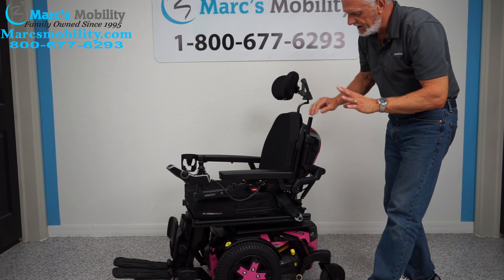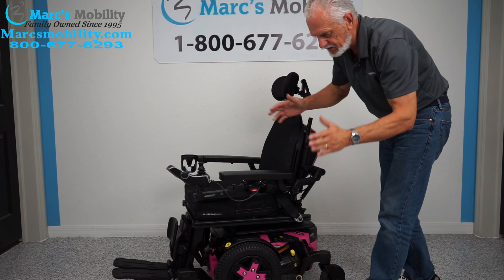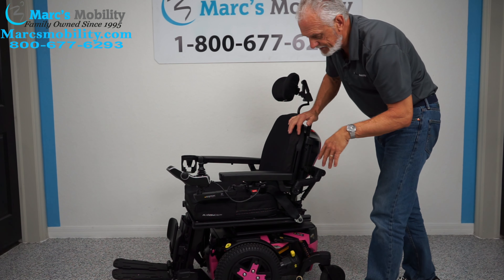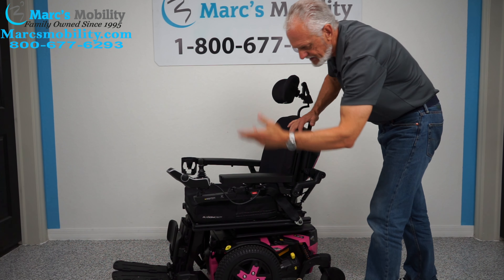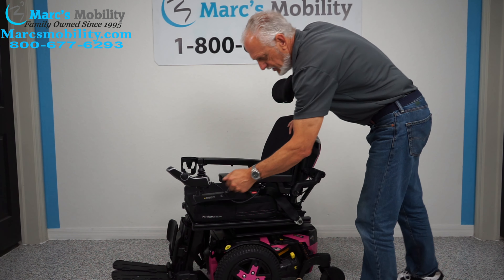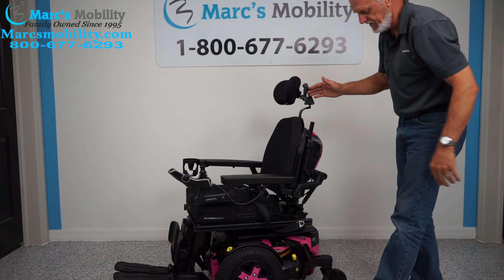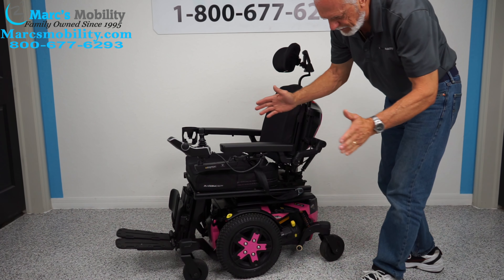This is the Quantum Edge 3 Stretto power chair — it's only 22 inches wide. It has 12 miles, the electric tilt, the electric recline, the electric feet, headlights, flip-up arms, the swing-away joystick, the safety belt, the cup holder, the adjustable headrest, the Stretto 3 suspension, and narrowness.